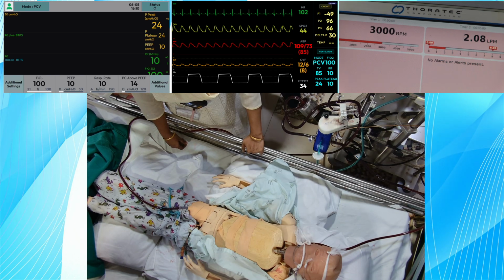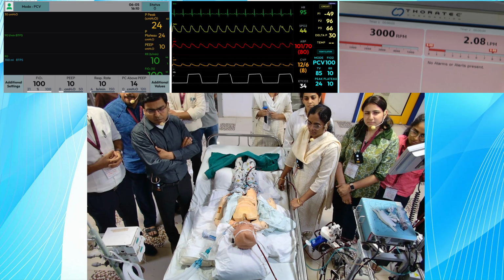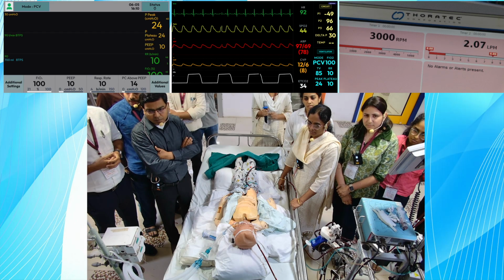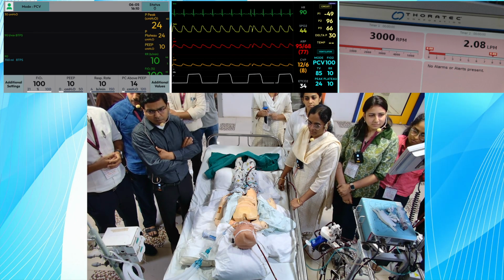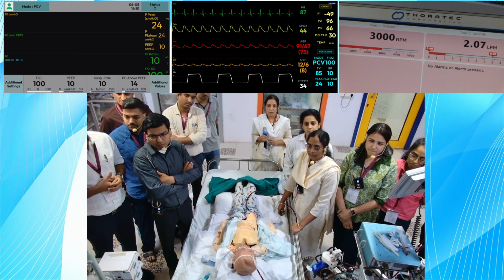I will give you 1 minute, 2 minutes. Think over what you are dealing with exactly. Is something wrong with the patient, or something wrong with the machine, something wrong with the ventilator? Because we are going in both directions, isn't it? So first you should broadly classify where you are. Then you will be able to focus more clearly.